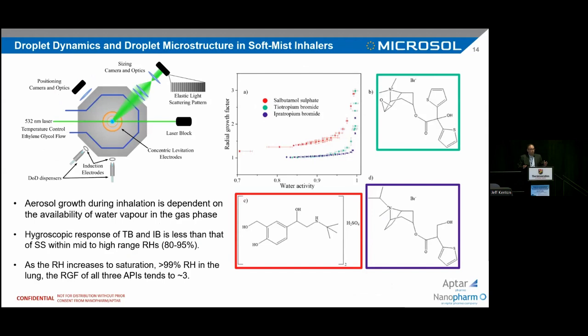But I'm really interested, going back to where I started, which is in nebulizers and soft mist, and I'm trying to look at this for MDIs also. So I'm collaborating with a spin-out from the University of Bristol Aerosol Science Group, a company called Microsol. And what they have is basically a single aerosol capturing system.